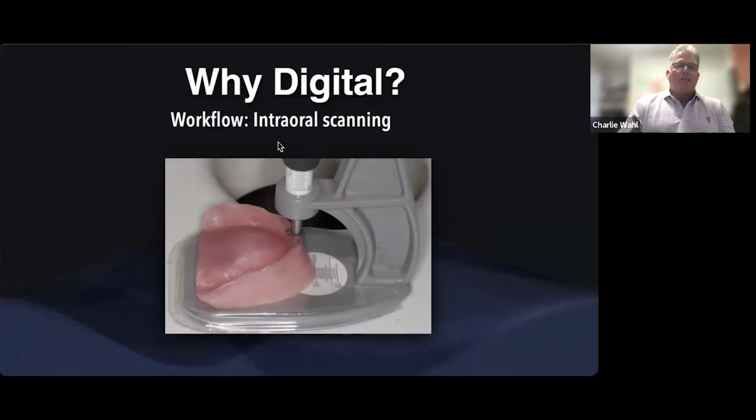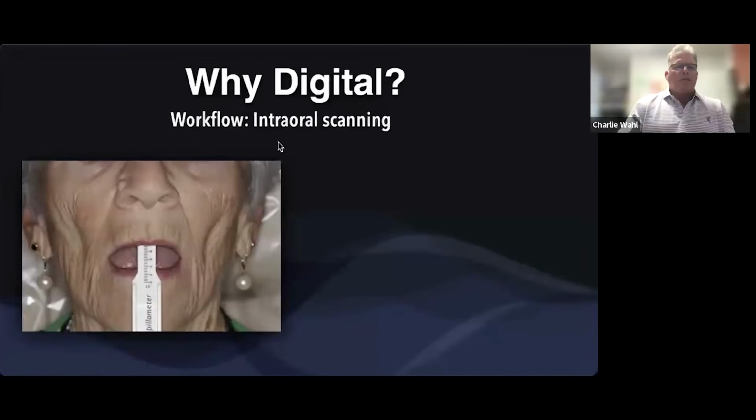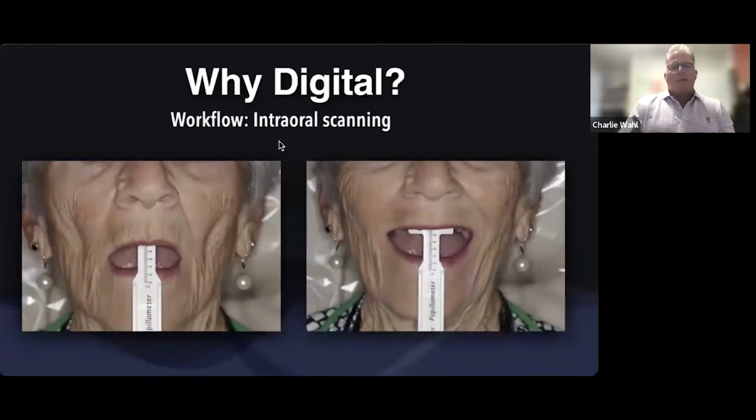An Alma gauge, I can use the incisive papilla and approximate where my incisal edge would be. Or I can use a papillometer and I can measure lip at rest, I can measure high smile line, and I can start to decide, hey, where should my incisal edge be? So all good guides, but I would rather want to know instead of assuming, based on averages, where teeth should go. And so I'm not a huge fan of just edentulous scanning.